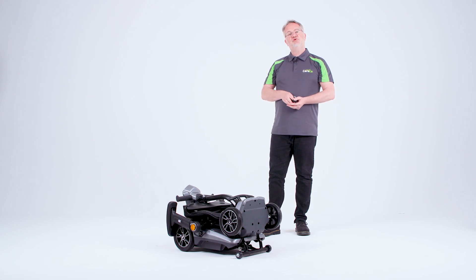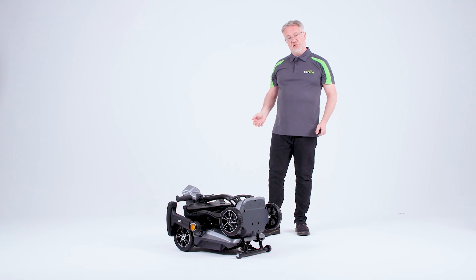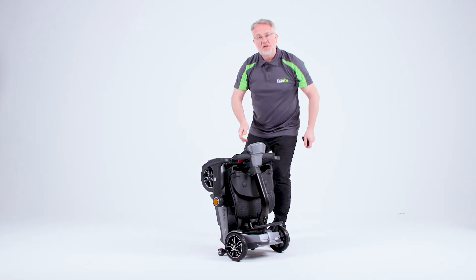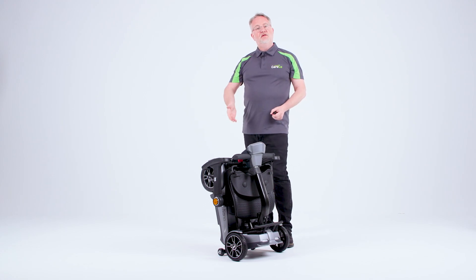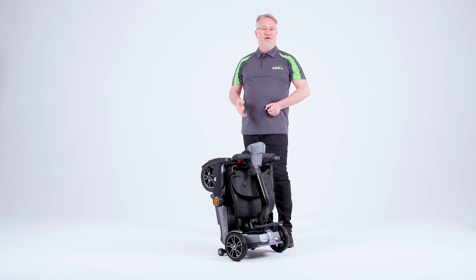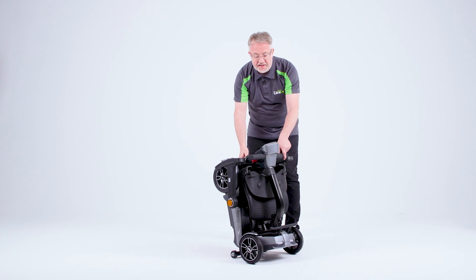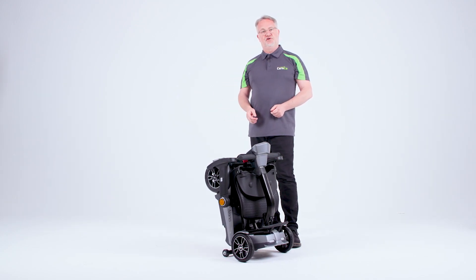Once folded, the scooter can be placed into the rear of a vehicle or you can stand the vehicle up as I'll show you now. You can then maneuver the vehicle around. The X-Go Nano doesn't come with a freewheel lever as traditionally used on other scooters. You can either use it as normal or if you want to maneuver it around the home, you would have it in this position, and then you can steer this around the home and place it under the stairs or wherever you may have space to do so.